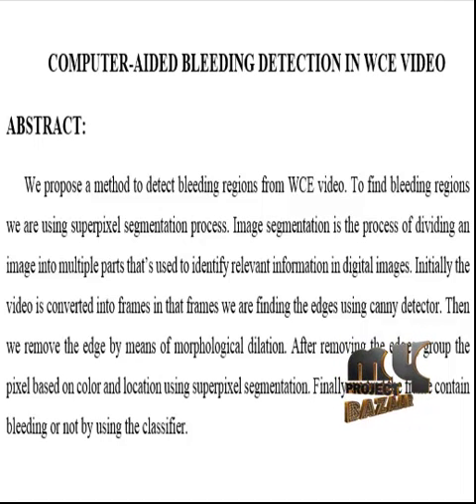The superpixel segmentation balances the complexities through pixel grouping. The initial seed point is grown in order to obtain similar pixels in the image. For this process, a particular threshold value is assigned for different video frames. The nearby regions were combined by identifying the similarities of the pixels.